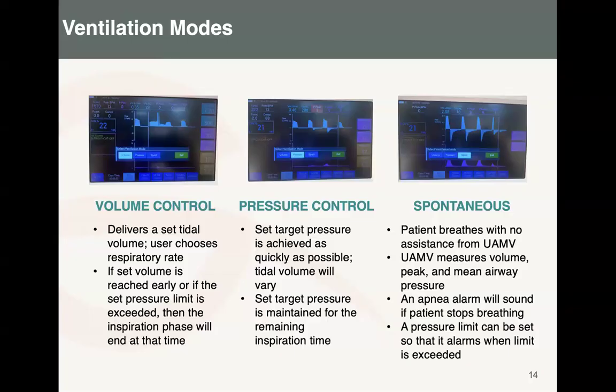It's always advised that if you are selecting the pressure mode, when putting the inspiratory pressure, start with low pressure and increase slowly until you reach your target tidal volume. Because if you start high, it might give you a very high tidal volume, beyond what you would like to give your patient, and that can cause barotrauma or any other type of injury to your patient's lungs.